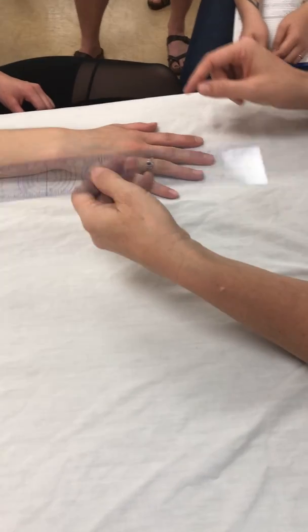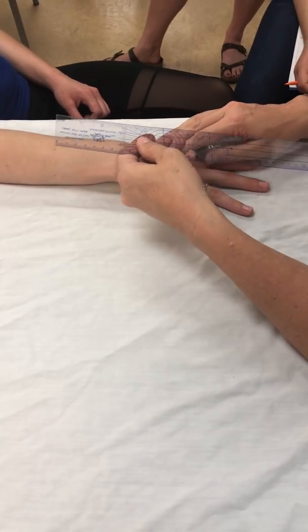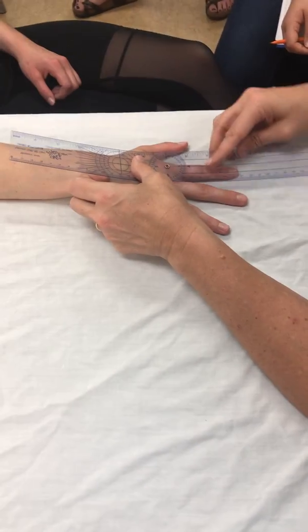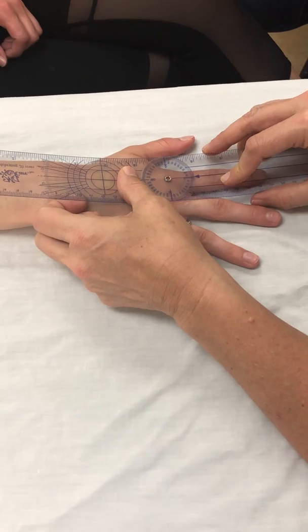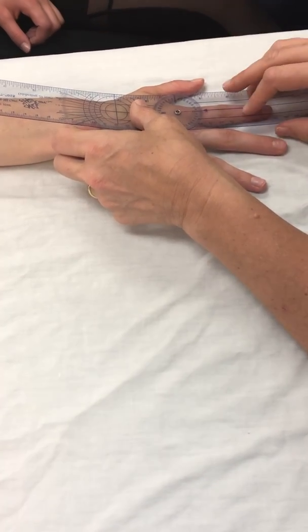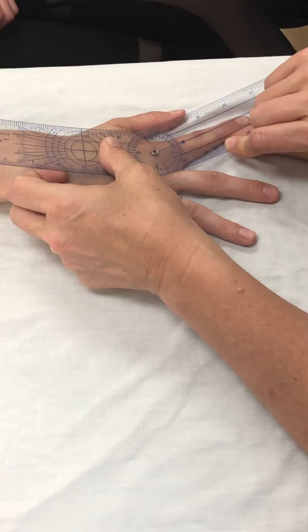Okay? But this one is going to be the same as any other. So I'm going to put my stationary arm along the metacarpal, and then my moving arm is going to line up against that with that proximal phalanx. You want to start at 0, okay, which means you might have to move the hand. If all the fingers are together, they're not going to be in a straight line relative to the metacarpal, so you may need to spread them out a bit to get them straight. And then from that 0 position, then you're going to have the person abduct. Okay?